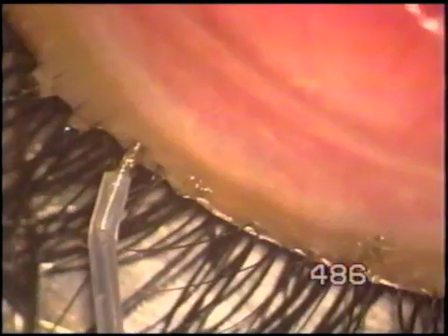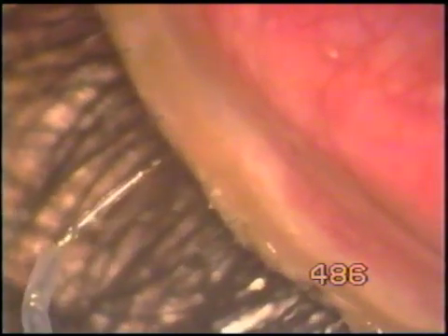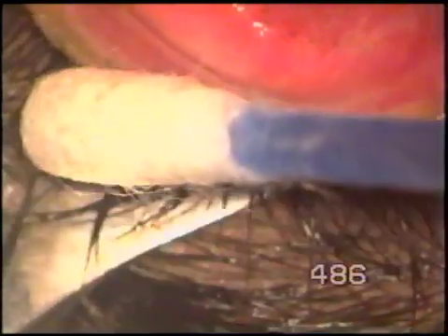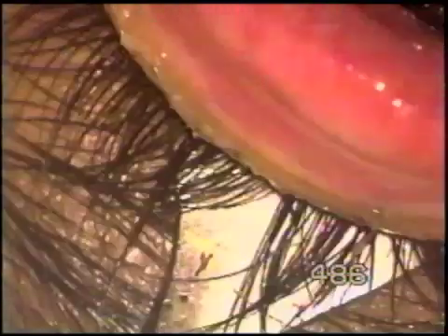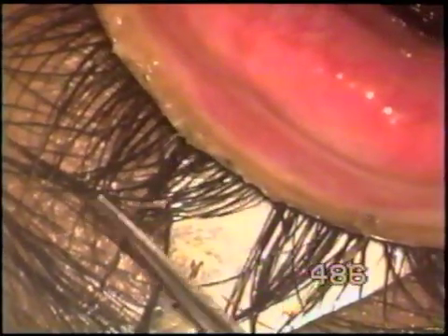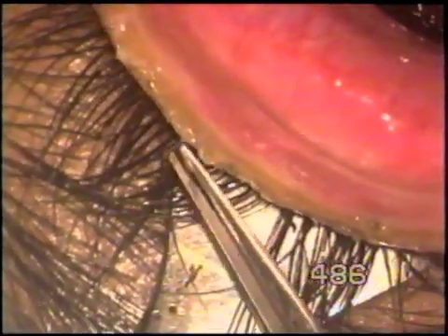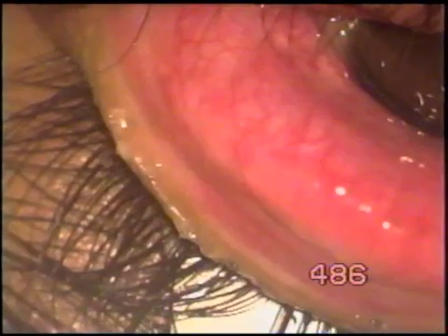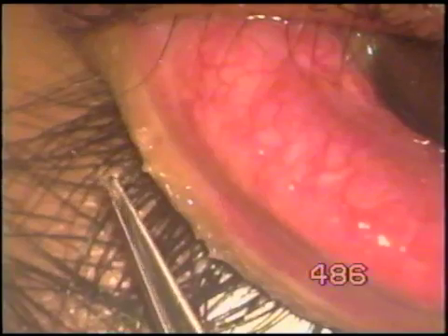It takes very little time and is atraumatic. Just go along the cilia, reach the root, withdraw the tip, and go to the next cilia. Pull out the loosened cilia so that they do not fall into the conjunctival sac. The same procedure is done for cilia in the lower lid. The cilia from all four lids can be treated in one sitting.